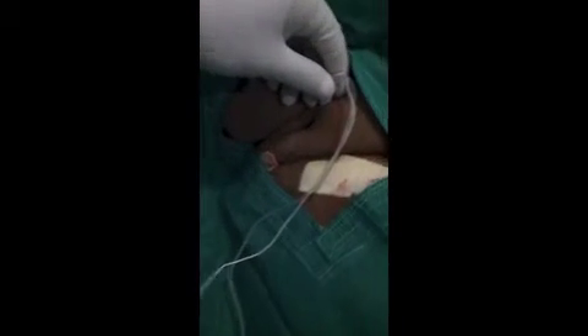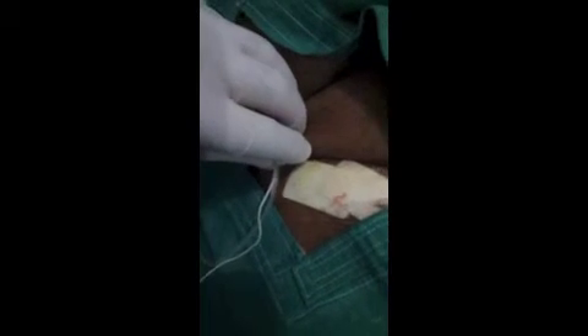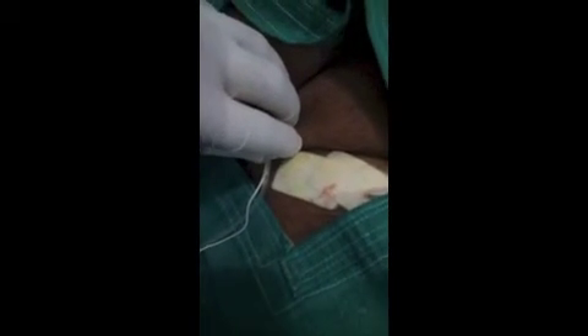So this is the Lateral Femoral Cutaneous Nerve block. You feel one pop — that is the pop of the fascia lata — and deposit 10 ml of local anesthetic. It is sufficient for the Lateral Femoral Cutaneous Nerve block.